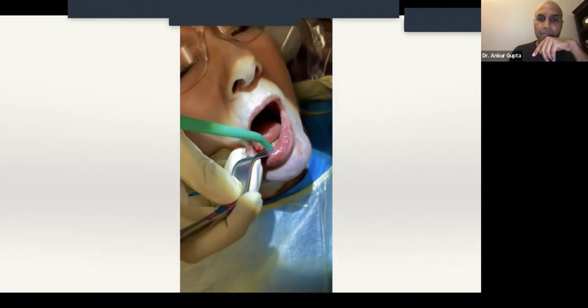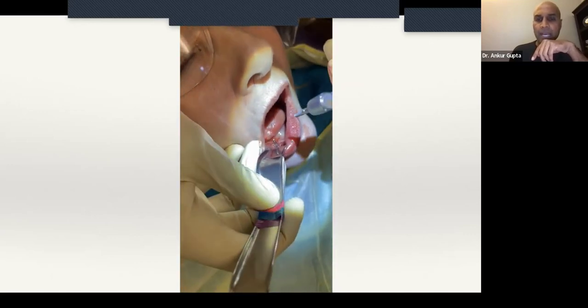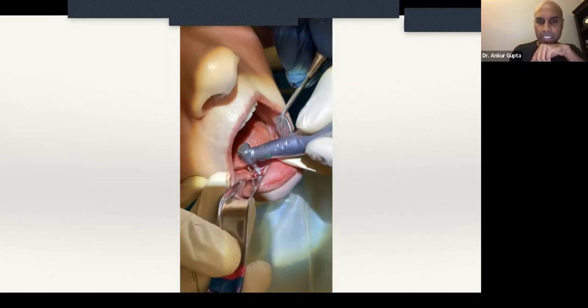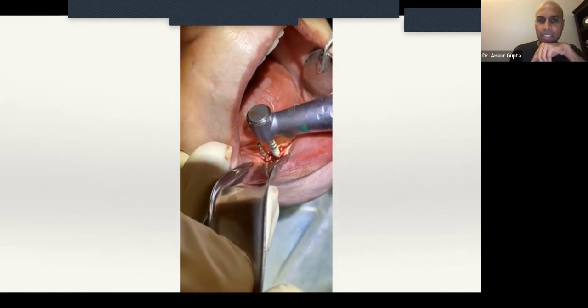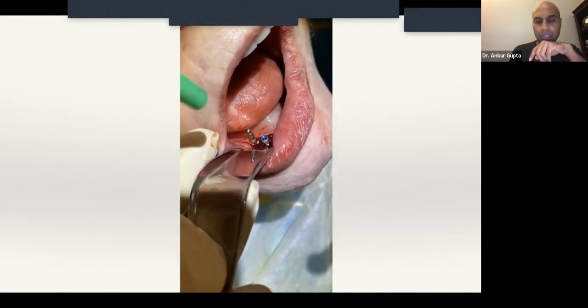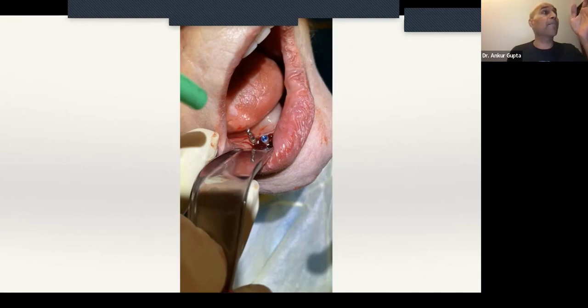Once you've used your surgical guide to drill all the little holes exactly where they belong, you open up your implant — this is an Implant Direct implant from their Legacy line, the implants I prefer for cases like this. I've laid a flap but removed my surgical guide. I have a parallel pin helping me determine the parallelism of my dental implant, and now I'm placing the implant into the osteotomy site, knowing I'm going to have excellent parallelism, excellent distance, and excellent distribution under my denture because I took the time to create a surgical guide.